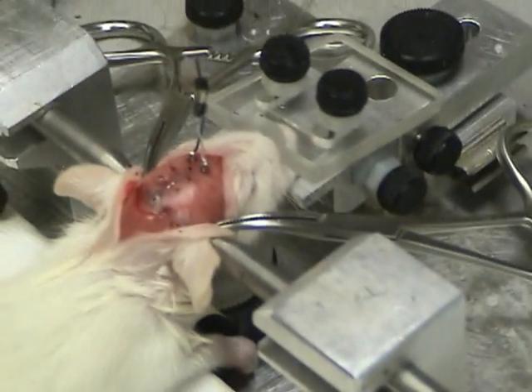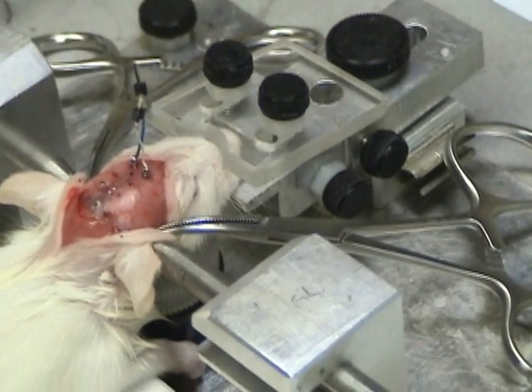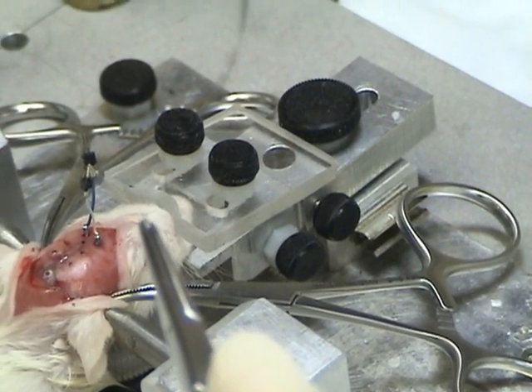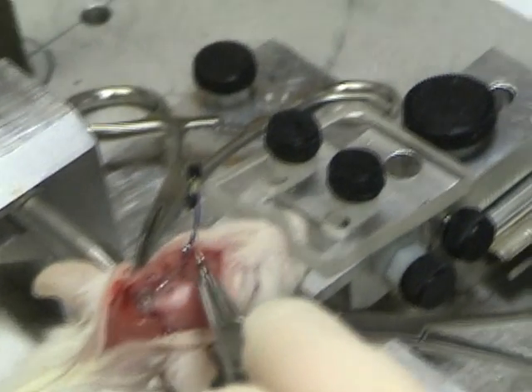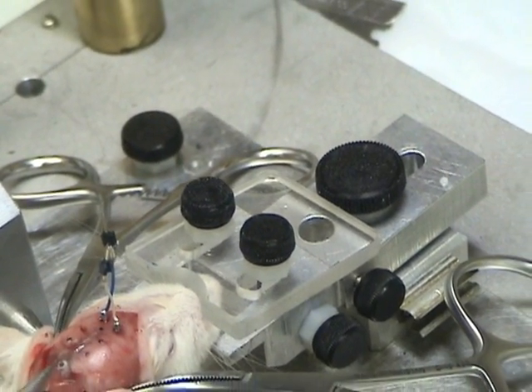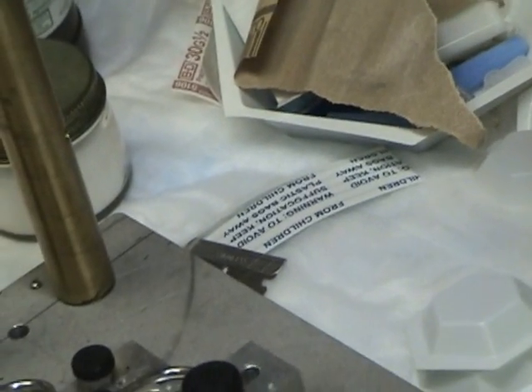Just one left for this one. For me, I'm going to use those two — the most frontal ones. In your case, I'm going to put the electrode right here and here, and the reference electrode in the posterior region.